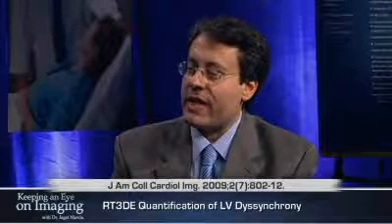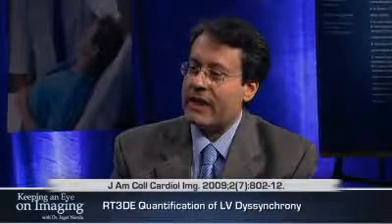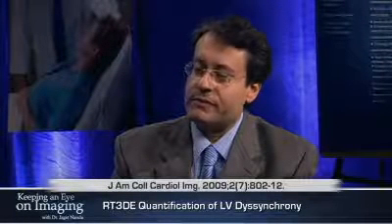Part of the problems with 3D echocardiography has to do with technical aspects. Having a lower frame rate is a disadvantage in comparison with other echocardiographic techniques. For example, in that study, the data was acquired from 8 cardiac cycles as opposed to 1 cardiac cycle, which is what is done with tissue Doppler. Image quality and adequate endocardial border detection throughout the duration of systole is important, and Victor alluded to the problems that happen with that. A third element that is also a problem is the approach itself.